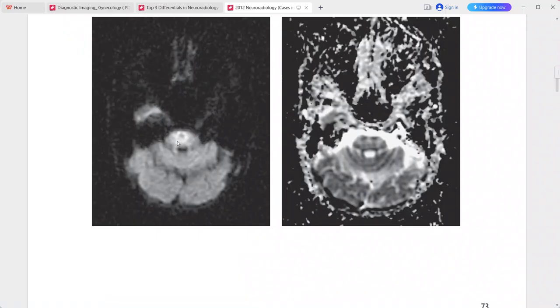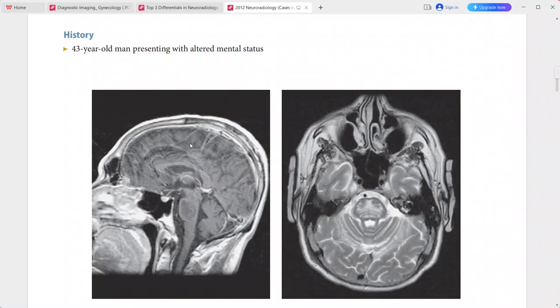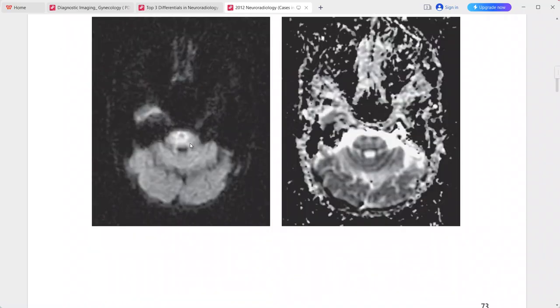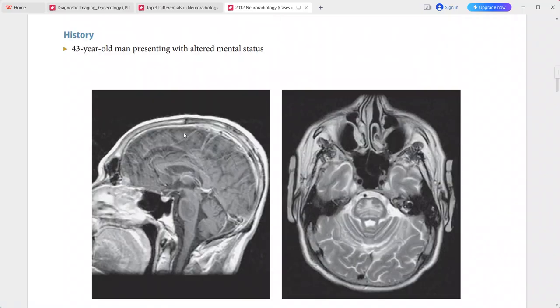There is no restricted diffusion in the pons on DWI. This is a case of central pontine myelinolysis, also called osmotic demyelination syndrome.